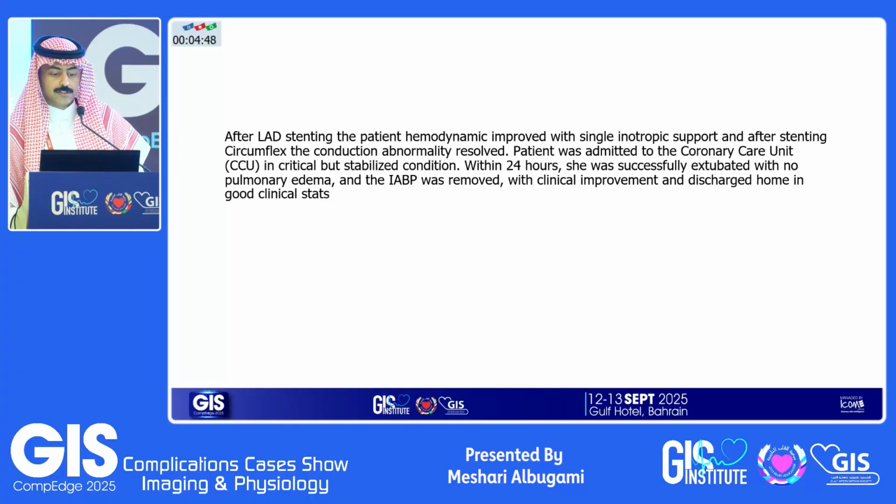After the LAD stenting, the patient's hemodynamics improved with a single inotrope support, and after stenting the circ, the conduction abnormality resolved, allowing us even to remove the TPM on the table while the patient was still in the cath lab. The patient was intubated at that time, and she had to stay in the CCU in a critical but stabilized condition. Within 24 hours of that event, the patient was successfully extubated with no pulmonary edema, and the intra-aortic balloon was removed. With clinical improvement, the patient was discharged home in a couple of days.